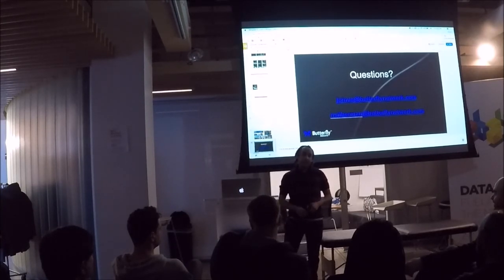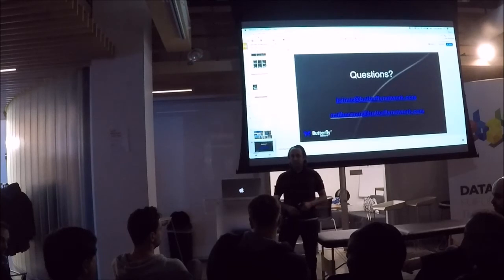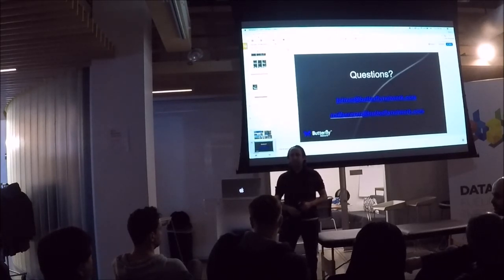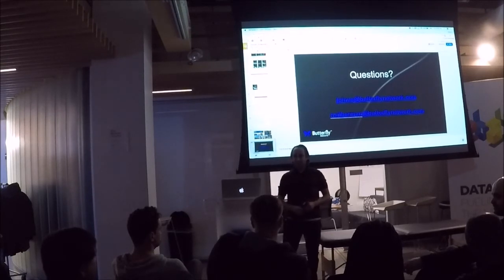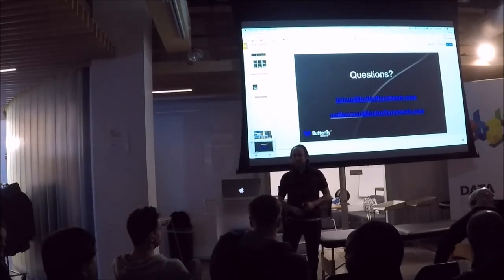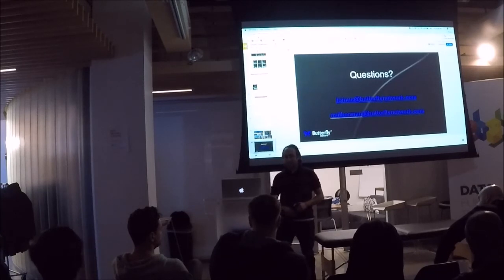This is something we might revisit in the future, but right now, the wire is actually surprisingly durable. Yeah, when I hear you use the word in the field, I'm also thinking about military applications. If you're talking about soldiers in the field where somebody has to get diagnosed before they try to ship them out or treat them right there on the spot, then having it wired becomes a little more challenging. Sure, absolutely true.